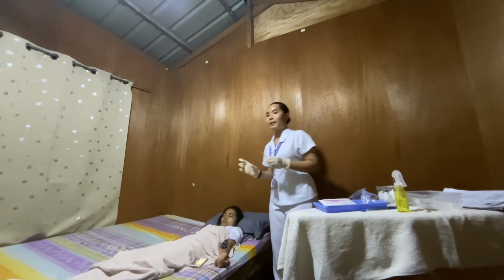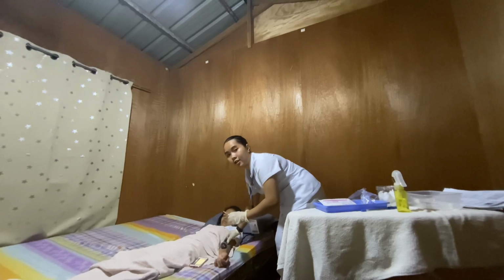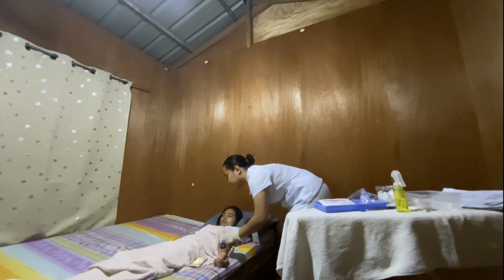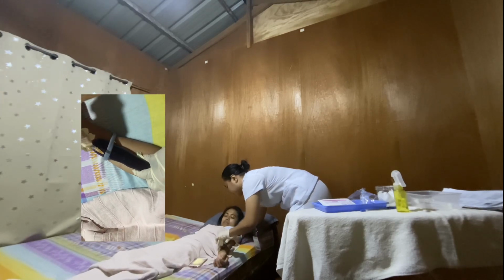With the non-dominant hand, pull the skin at the site until it is taut. Taut skin allows for easier entry of the needle and less discomfort to the client. Next is to insert the tip of the needle far enough to place the bevel through the epidermis into the dermis.